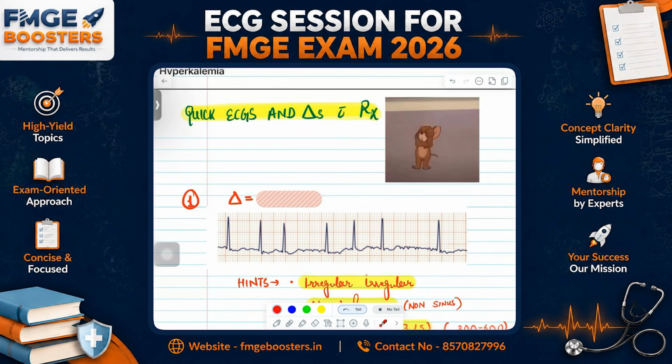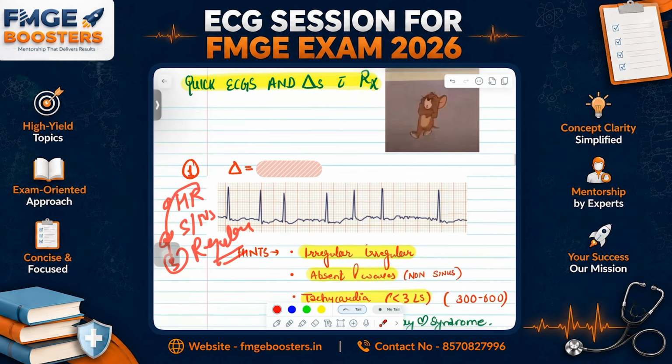Okay, now we'll start the important things for our examination, which is ECGs, and you will answer me whenever an ECG comes in front of you. Tell me the heart rate, tell me sinus or non-sinus, and the third thing you have to tell me is regularity. Now tell me this ECG. Tell me the heart rate. Is it regular or irregular? Is it sinus or non-sinus?